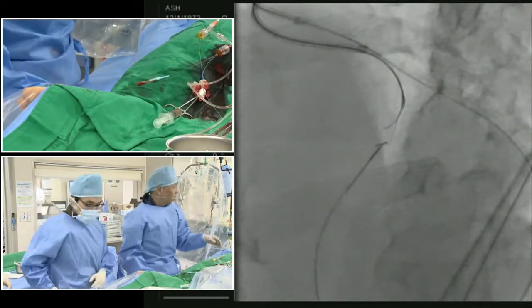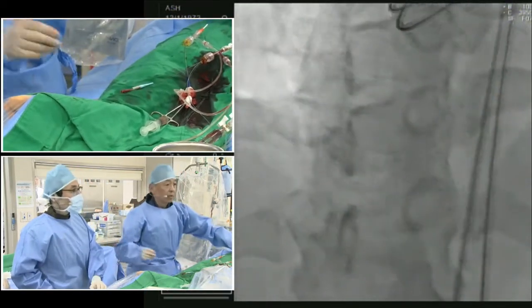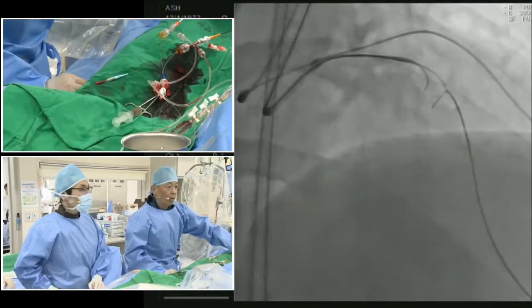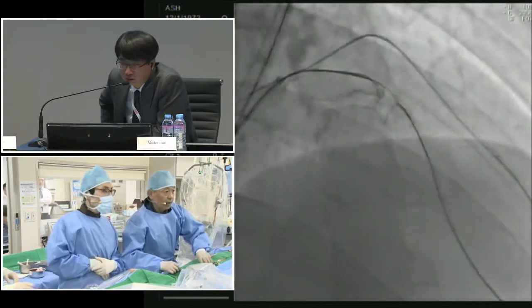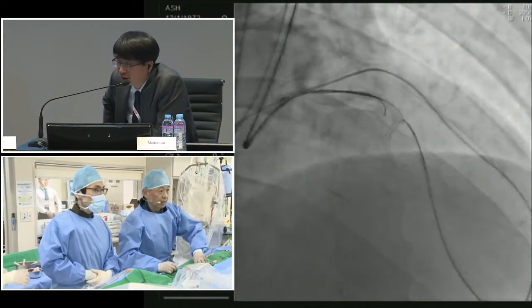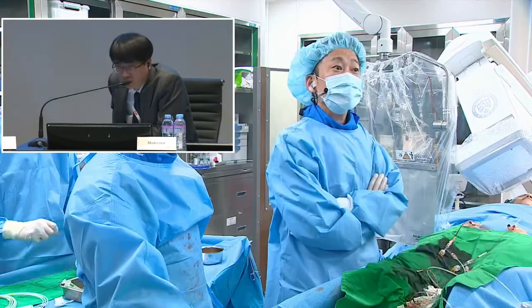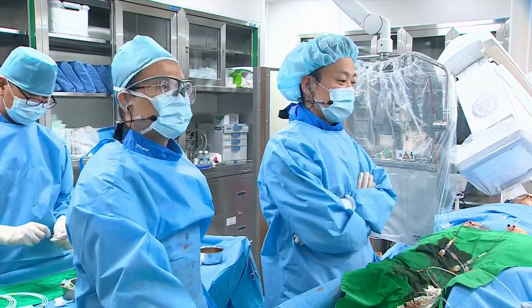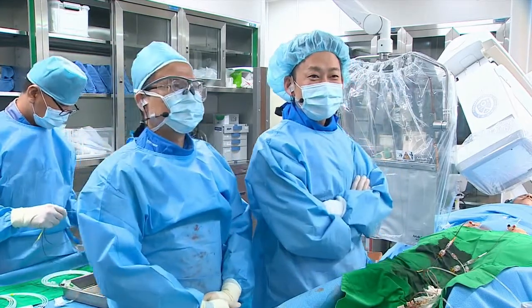Okay, back to the caudocranial. So please stand by. Conquest. Iga Sensei, yes, another room is ready. So you want to move to another cath room. Yeah. Have your time. Hello, hi, Dr. Nasu. Hello. Here on the screen.